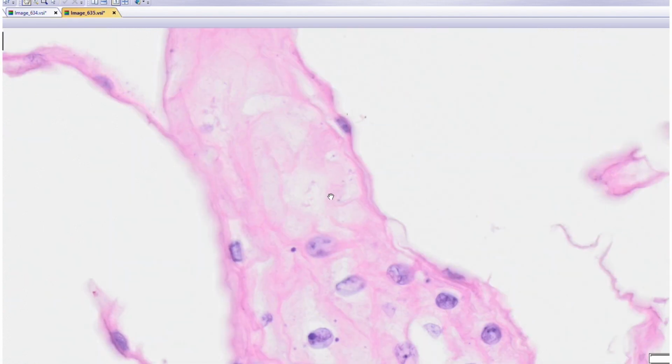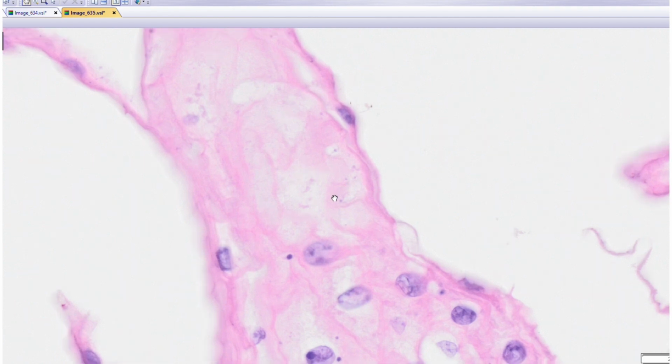I would hope that some parasitologist or pathologist somewhere in the world would be able to identify this, but I don't have access to that expert, and I have tried everything that I could possibly imagine to get access to an expert who can help identify this.